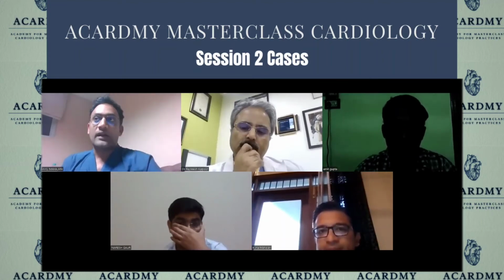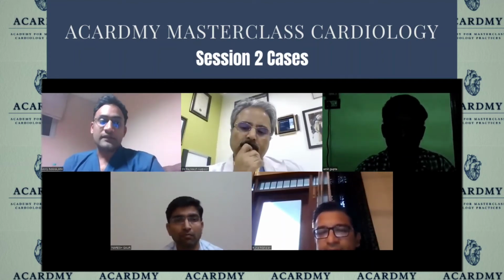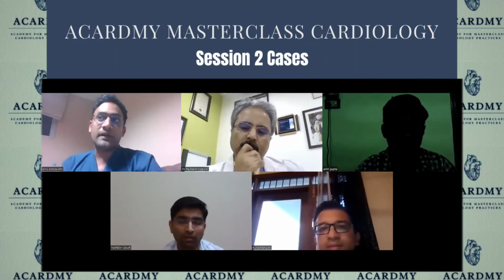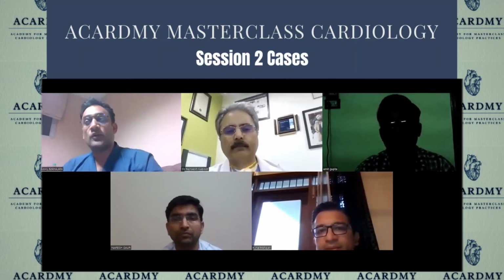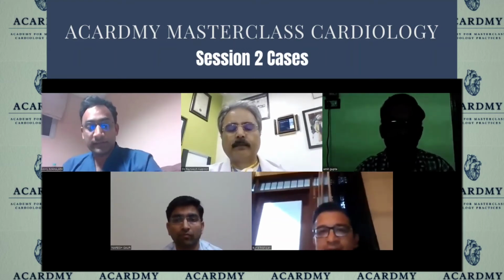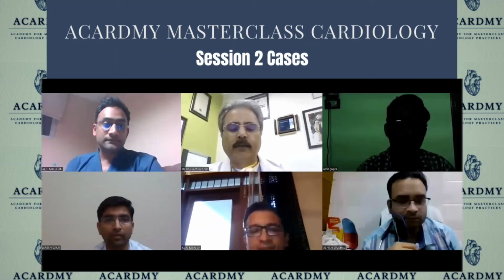And the cutting balloon had already been discussed with the patient previously. So I thought preparing the bed would be better rather than to stent and then do post NC and OPN and all those things. Very appropriate. Great. Yeah. So Sahil, wonderful case.